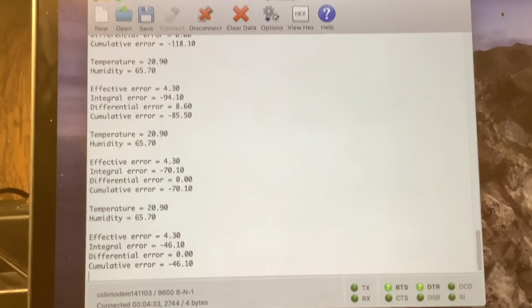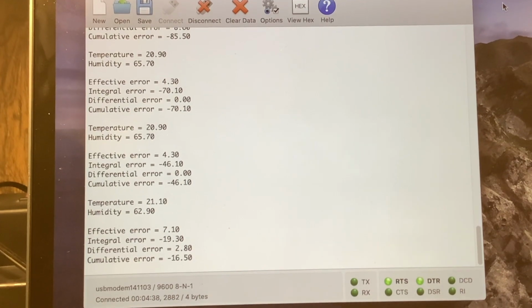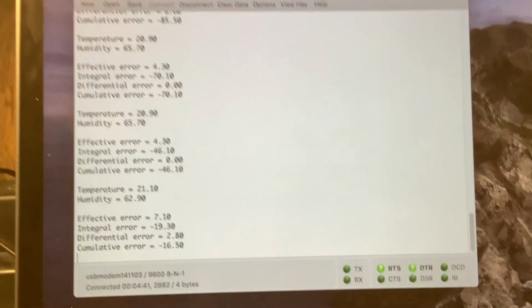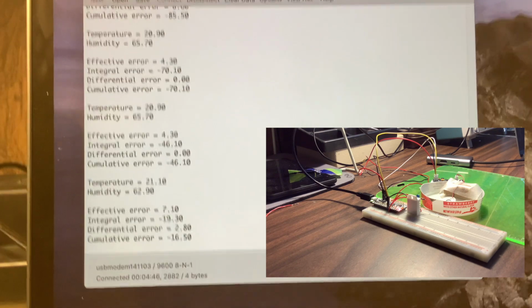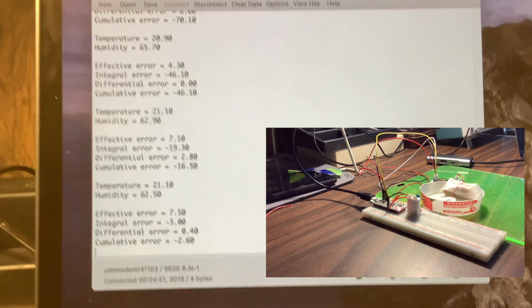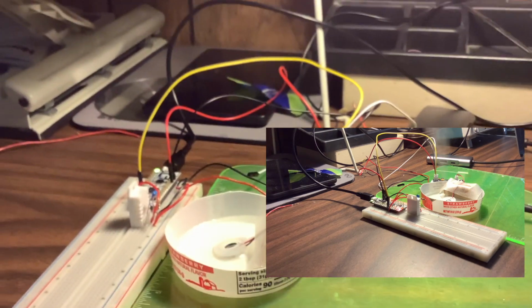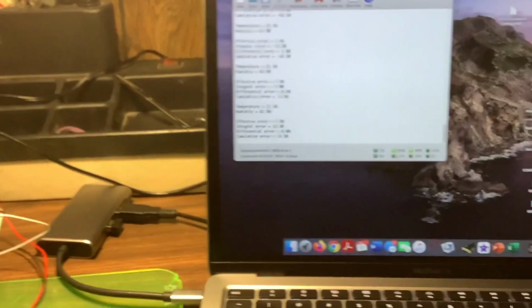Now we can see in our measurements we're coming from the other side. The cumulative error is getting less negative, which means we're getting close to wanting to turn the humidity back on. So we can see that the humidity is overshot a little bit and below our 70% set point, but now we can see that the error value crossed over into the positive and we turn back on the system.